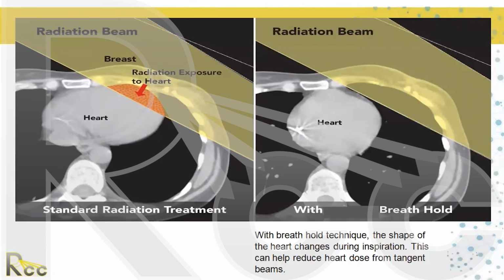So if you're taking a CAT scan of the patient, you can actually put a monitor on the patient that checks for breathing. And every time the breathing is in a different position, you take a different CAT scan. So you now have a movie, a CAT scan cine movie of breathing. You can actually make a movie, not just static images. They call it 4D imaging, where you're looking at movement. You can create a movie of the movement.